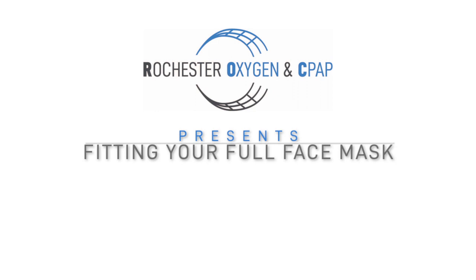Hi, my name is Mike. I'm a registered respiratory therapist and in this video I'm going to show you how to fit your CPAP full face mask. These masks do have cushions that can come in several different sizes and your respiratory therapist can help you select which one works for you.